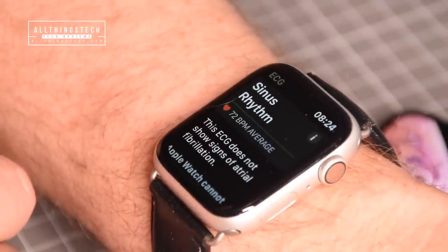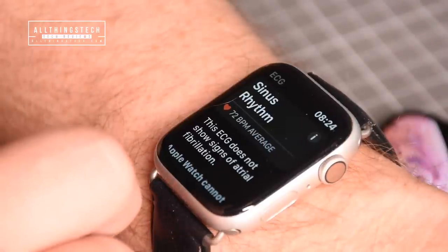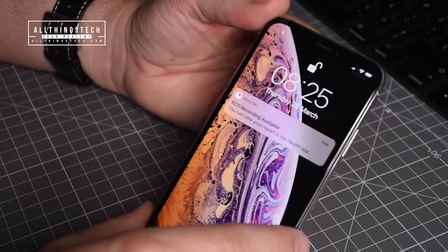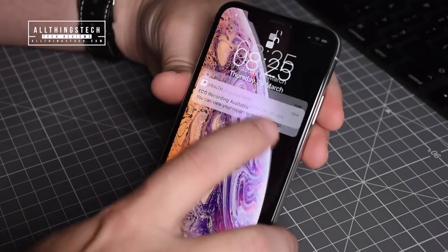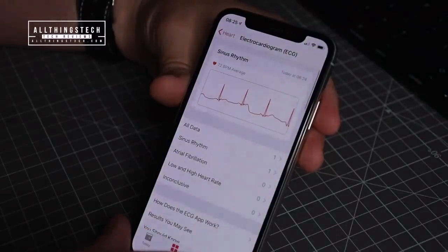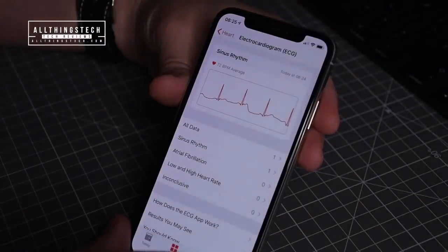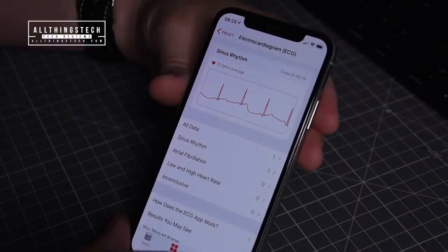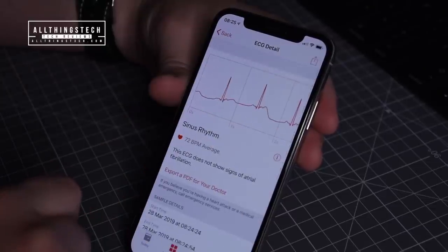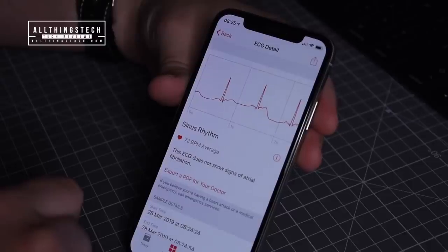When the 30 seconds are complete, it gives you immediate feedback on your watch. It says the ECG does not show signs of atrial fibrillation, which is a good thing. You can then head over to the Health app on your iPhone for more information — a prompt on the home screen will show there's an ECG reading, and clicking into it gives you the full ECG reading with more detail.